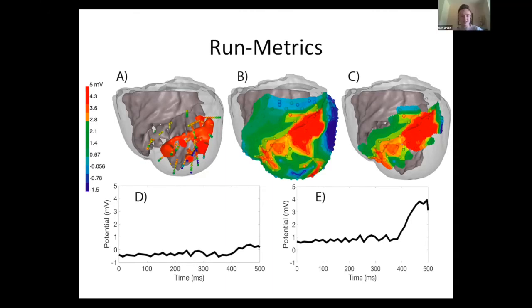What it did is it found the most elevated neighborhood, something in this area, and then it found what the average value is. Then it grew if the adjacent electrodes were within a certain parameter from that average value. So it just expanded to cover the region if it was contiguously elevated. Okay, got it.